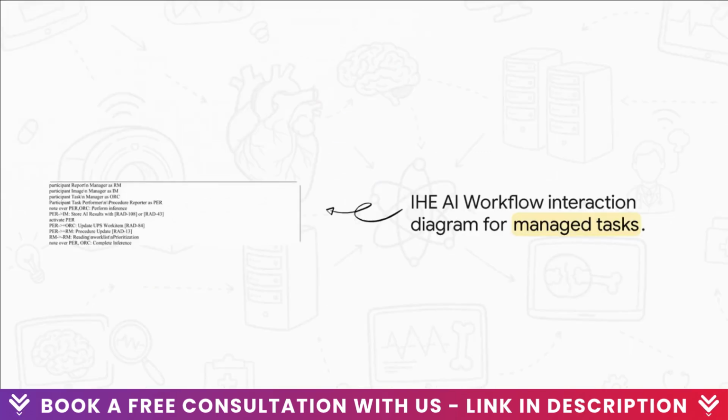Standardizing your workflows with the IHE AI workflow profile allows you to treat AI models as managed tasks. By using RESTful DICOM UPS-RS transactions, your task manager can seamlessly request, manage, and monitor these AI inference tasks. Whether your AI model is hosted up in the cloud or running locally on-prem, this standardized pull or push workflow ensures that the results, like a flagged abnormality or a generated markup, flow securely back into the image manager and instantly update the radiologist work list.